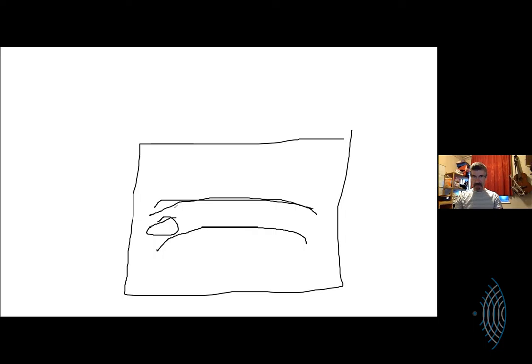Okay, and now keep going here. Yes, when you look in short axis, you need to make me find this on your scan. You've got the supraspinatus, the bursal layer there, the bony layer there, and you've got your biceps sitting there, slightly flattened. Anterior is left. Is this side? Yes. That's anterior. And that's posterior there. So you've got biceps there. This is your short axis view of supraspinatus, with the bursa going over the top.